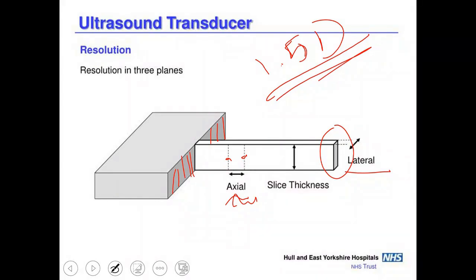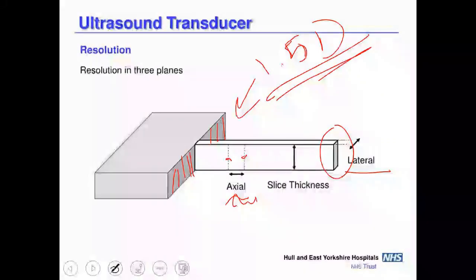Regarding the elements present on the ultrasound transducer, there is a mention of 1.5D elements, elevation, and improvements in slice thickness, which I consider to be under research. There is work being done to improve slice thickness in ultrasound imaging. Design technique or design technology is considered under design specification.